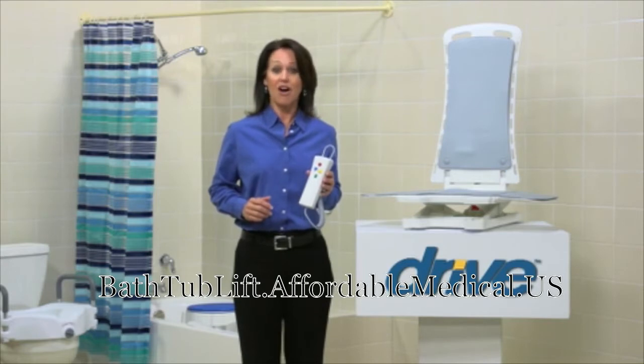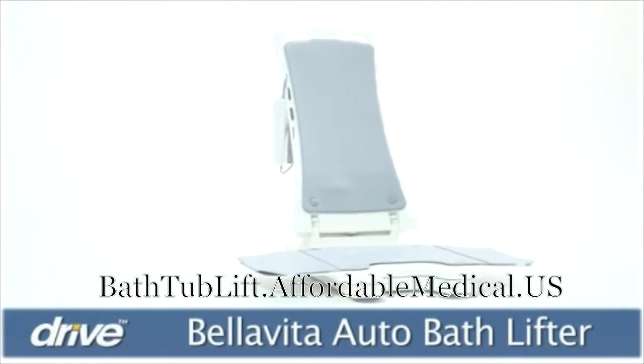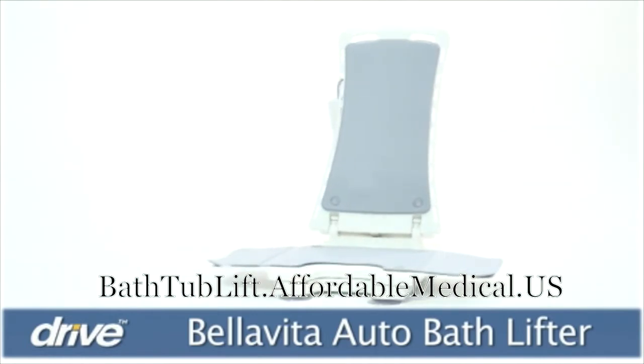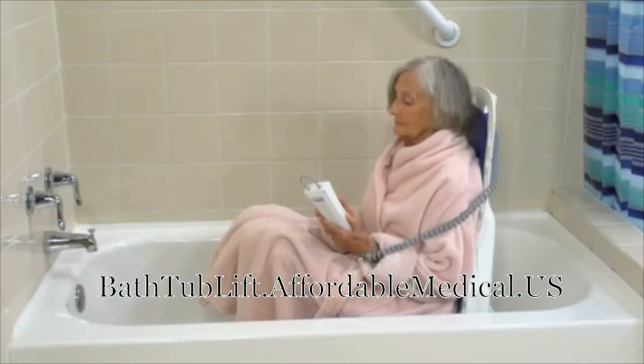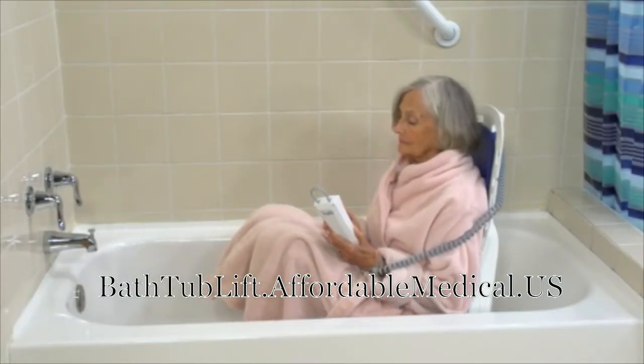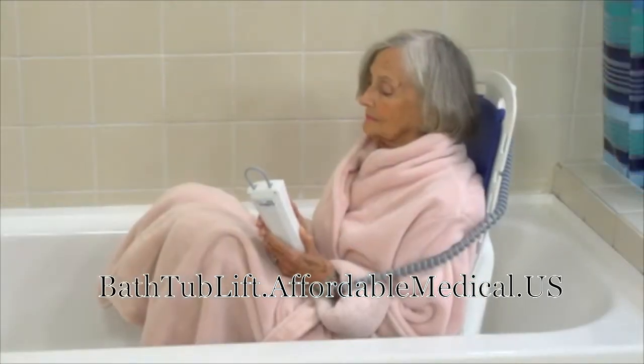This two-piece bath lift is easy to assemble, install, and operate with no tools required, and fits into standard and deeper tubs. Weighing only 20 and a half pounds, the Bella Vita is the lightest bath lift on the market, but it can safely support up to 300 pounds.